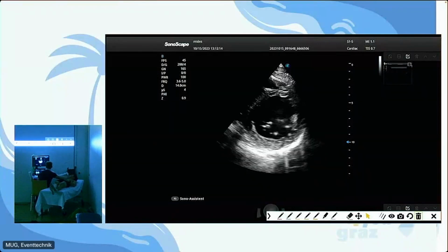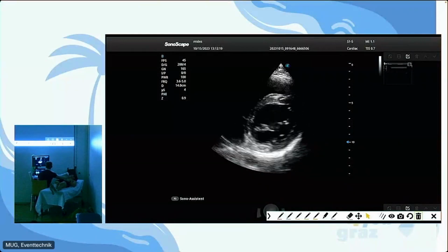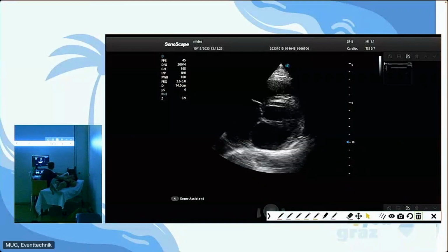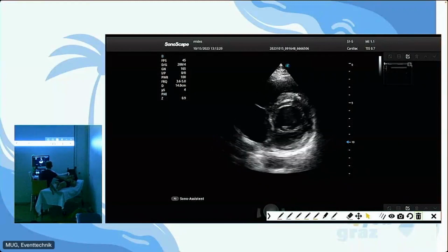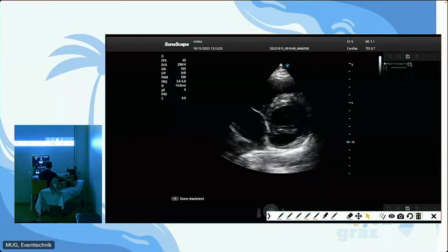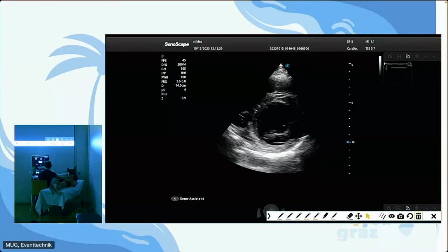If you start back at the mitral valve and he moves his probe towards the sternum, then you're just going to see more of the right heart, but if it's too far, then there's just bone and you're not going to see anything. And if you move to the left shoulder, then just the lung will cover up the heart. So that's not any helpful.